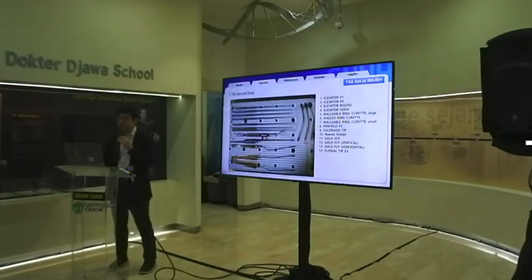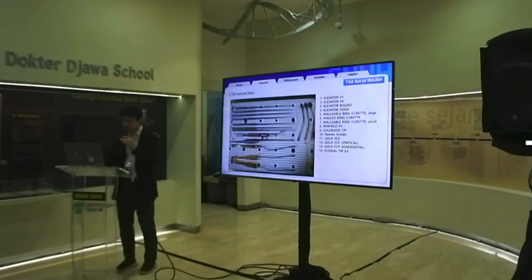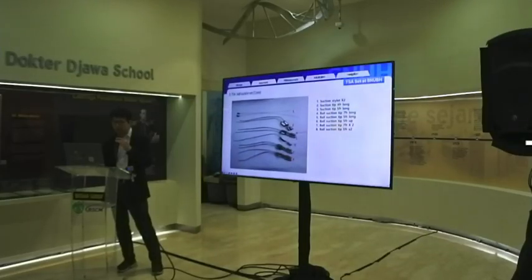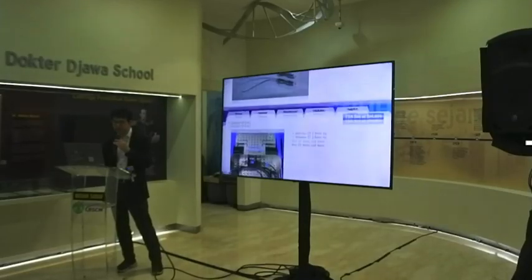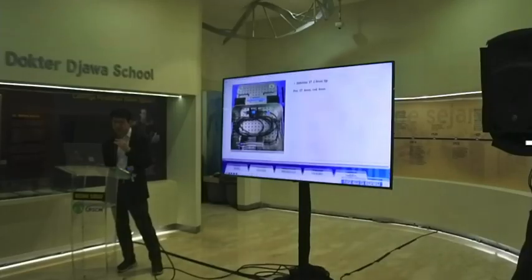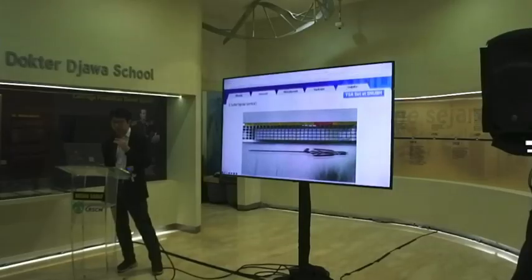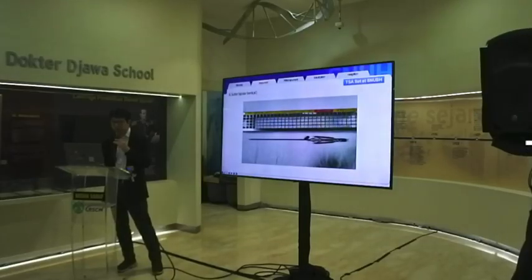So at first, when you are studying endoscopic surgery, you should get used to this old micro set. This is the micro set for rotating straight scissors, and left and right scissors. So it will be very useful for your residents and nurses to be educated with this slide. And this is the debrider. And the camera depends on the equipment company. And this is the bipolar.